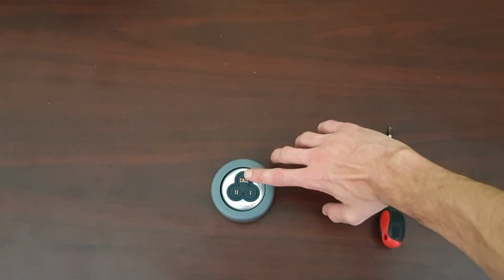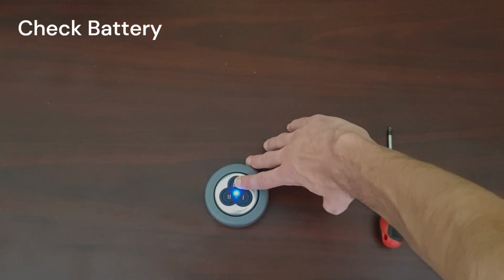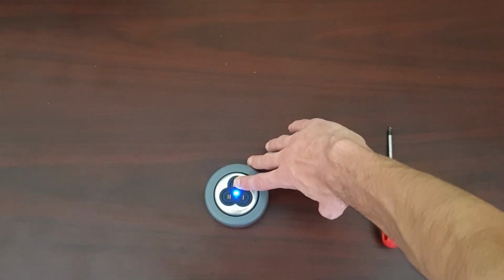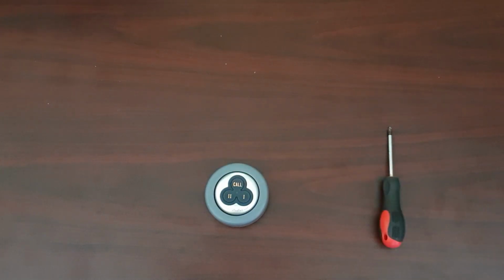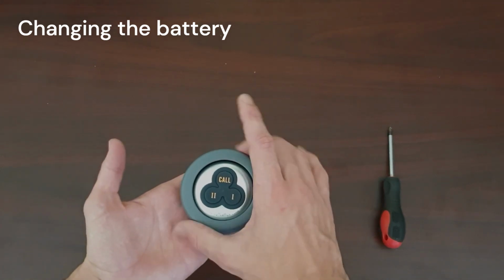We'll start off by pushing the button. You'll see there's a blue light. This blue light indicates the battery level. If you see that this light goes dim or is off, you know that the battery is going low or is flat. To change the battery, you go and unscrew the holder.